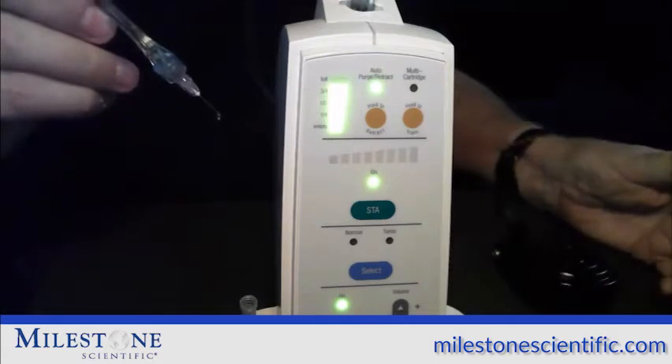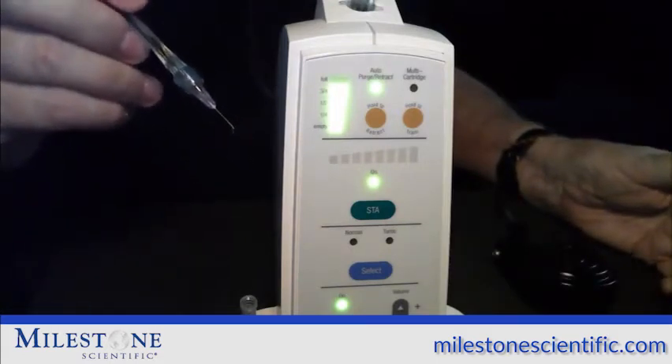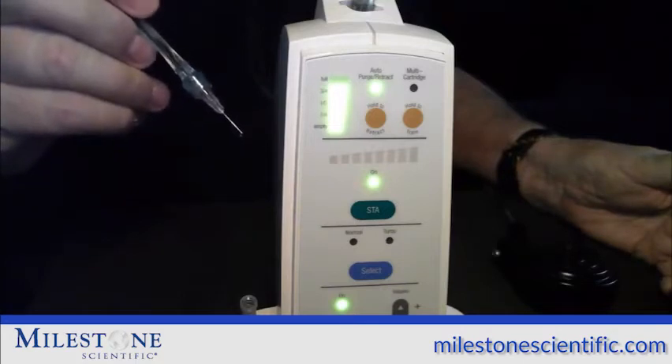At that time, take your foot off the foot pedal and the instrument is now on cruise control, and it will continue this flow rate throughout the whole injection.